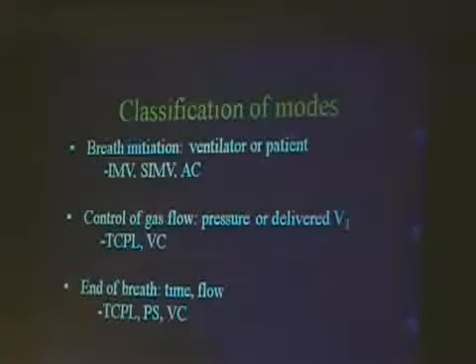All right? So we've really gone over two really critical things that you just have to remember whenever you're ventilating a baby, and that is optimal mean airway pressure, and for conventional ventilation, appropriate use of tidal volume. And as I think we're going to say at the end, but I'm going to say it right now, again, if you've got an appropriate tidal volume and you have an inappropriate mean airway pressure, you will still damage the lung.